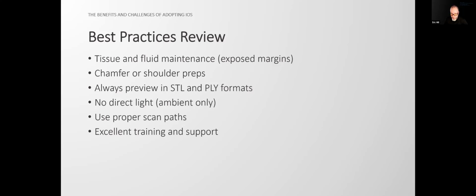You can usually overcome this, and I hesitate to say this because it's not always true, if you back away from the tooth a little bit. That way, the light from the scanner itself is not overwhelming the screen. So just pull back the scanner a little bit. That lessens the light, and then usually you can capture that. If you're not able to capture that, and you're going with an ortho case that requires those areas, that's another scenario where you might want to consider using a traditional impression.